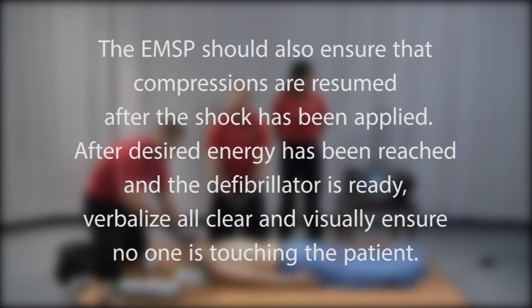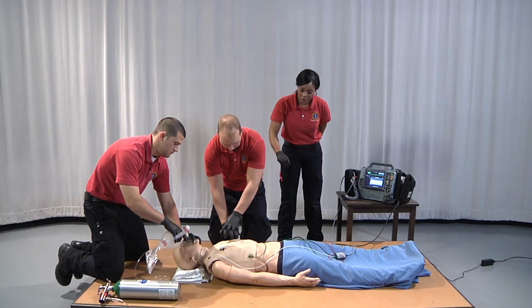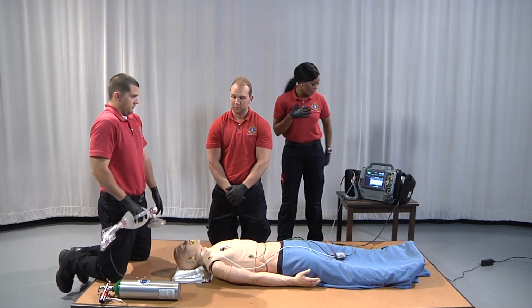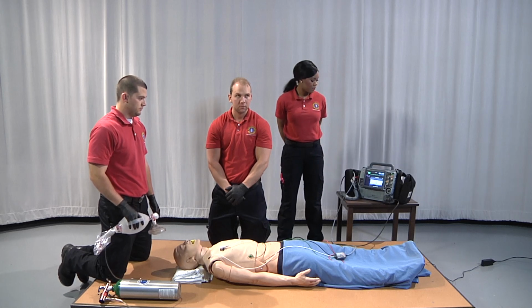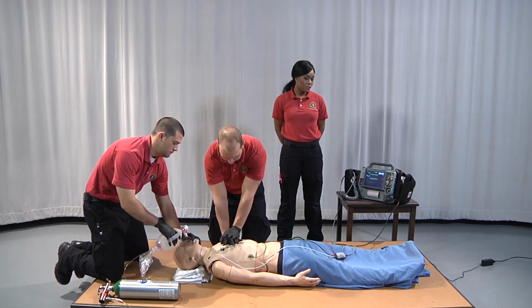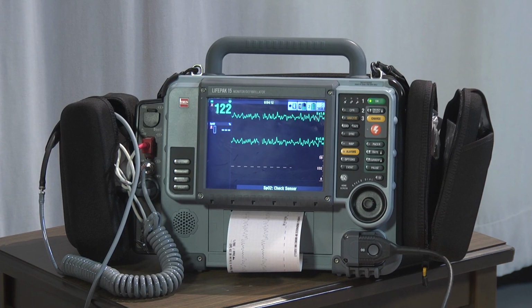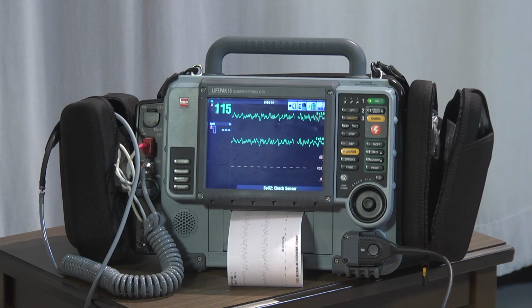After desired energy has been reached and the defibrillator is ready, verbalize all clear and visually ensure no one is touching the patient. Clear the head, clear the feet, all clear. Depress the shock button to deliver the energy. Immediately resume compressions after energy has been delivered. Continue compression and defibrillation cycles based on current recommendations.